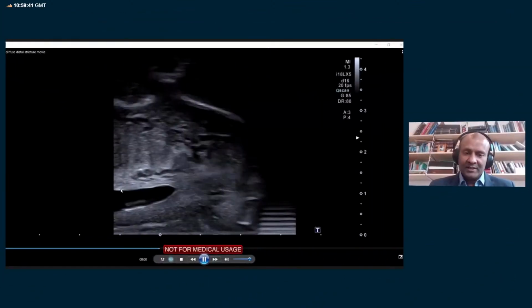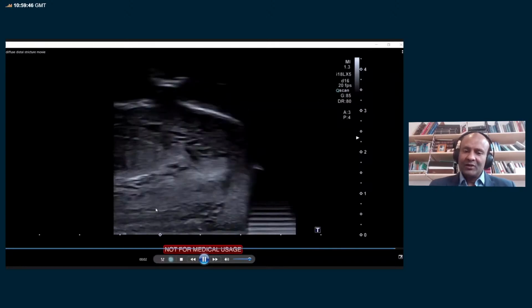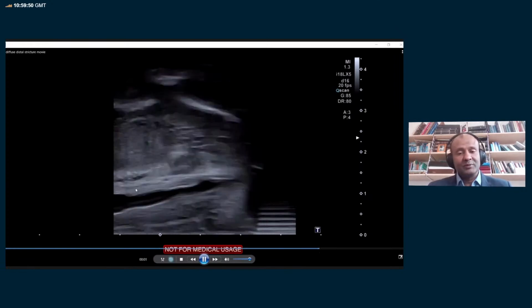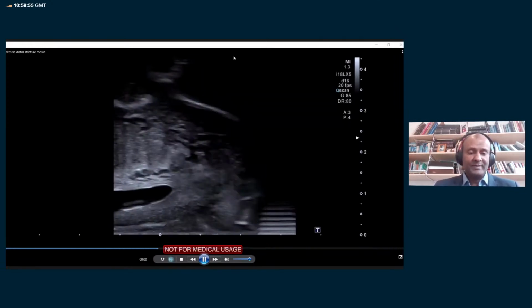This is another one. You can see even longer abnormal scar tissue coming along here, quite long. So that one would definitely be not just a simple meatoplasty, but that would be a 2-stage buccal mucosa graft urethroplasty.